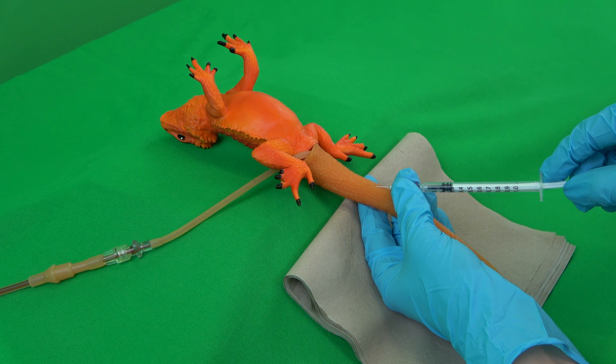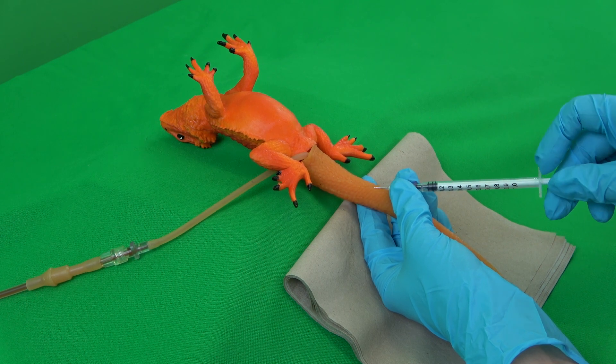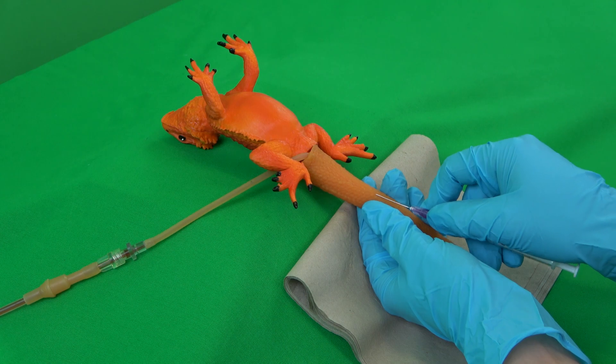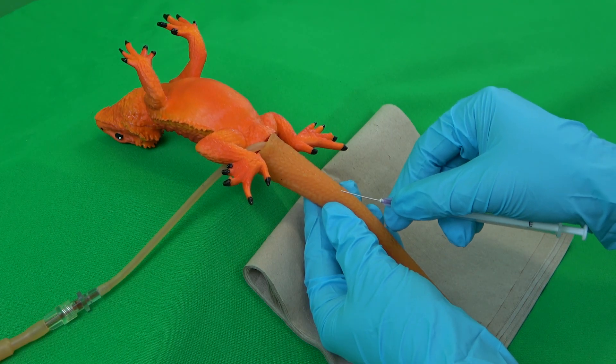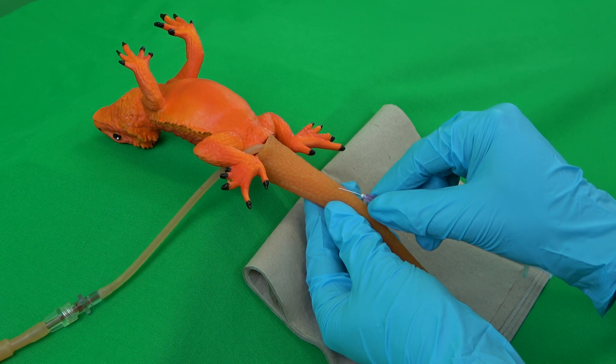If blood still cannot be seen, both syringe and cannula must be removed from the patient. The used cannula is then properly disposed of and replaced with a new cannula. A new puncture spot should be chosen further proximal.